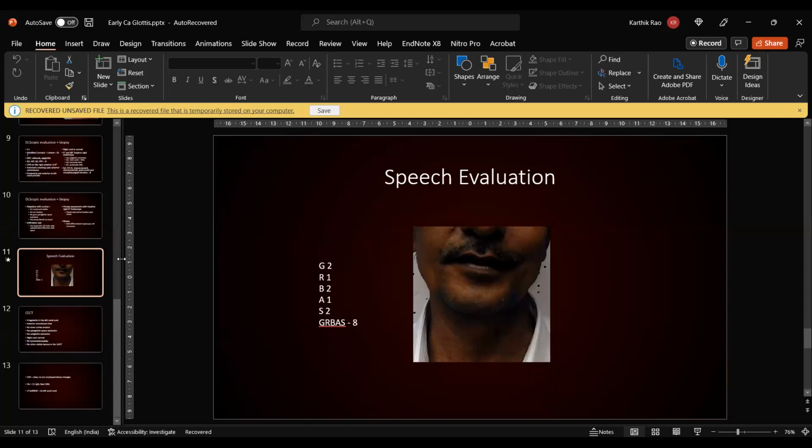Karthik, what are the advantages you see of laser over radiotherapy? Sir, number one, laser surgery in certain scenarios can be done on a daycare basis, or with a minimal number of days of admission without requiring much hospital stay.